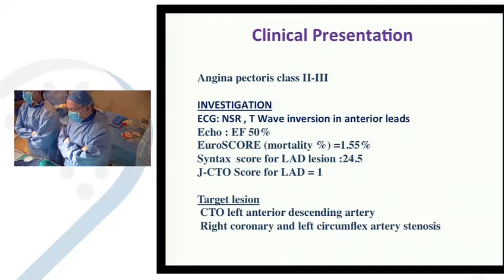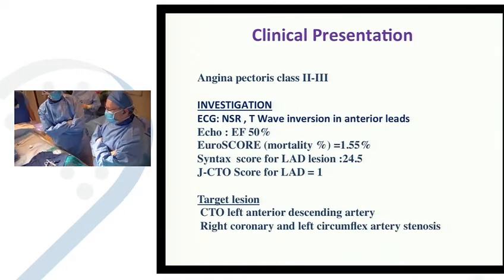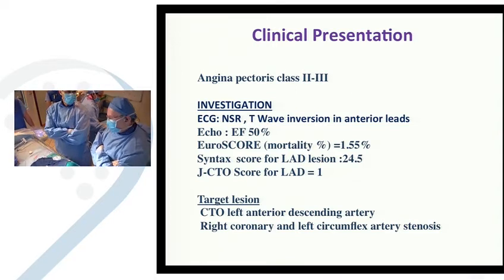is 1. I don't think it's 1. I think it's 2 because it's calcified and a long lesion. Long lesion? Yeah. Severe calcium? Yeah. So it's 2. If not 3, because it's, no, yeah, 2.